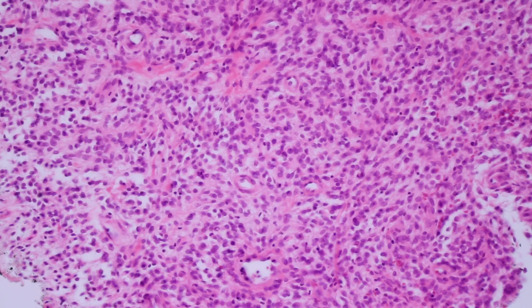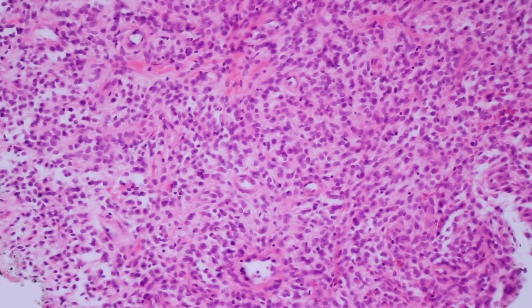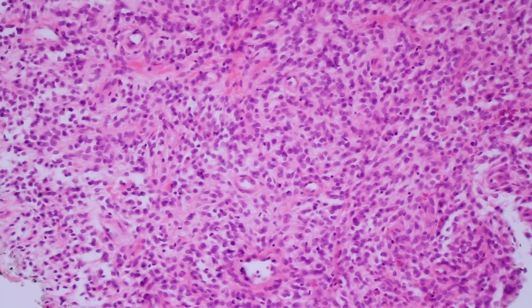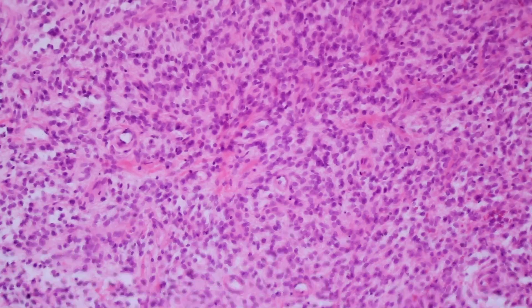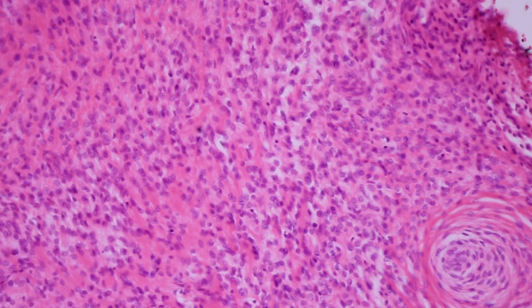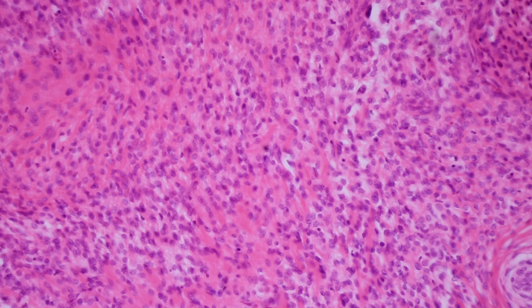That uniformity is a clue: when you see cells that all look just like each other in a soft tissue tumor, that's oftentimes a sign of a translocation-associated tumor, because every cell has the same molecular abnormality. Whereas pleomorphic tumors often have multiple gains and losses or aneuploidy. It's not a hard and fast rule, but a useful trick one of my mentors, Mark Edgar, taught me. These round to oval cells have very bland nuclei with little pleomorphism or atypia.